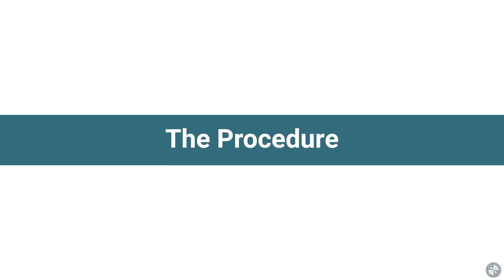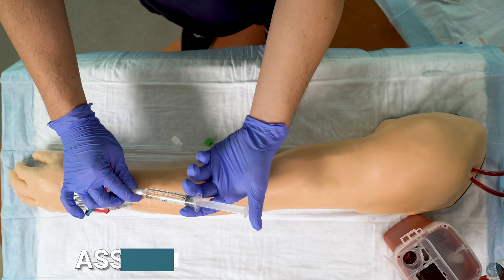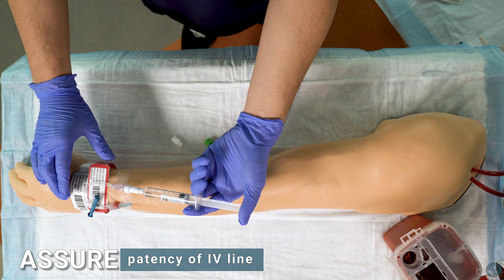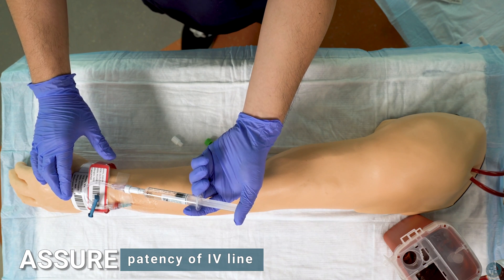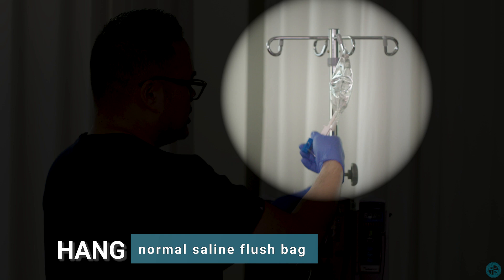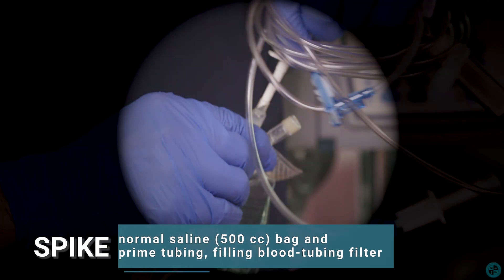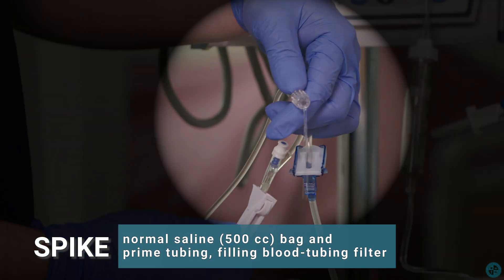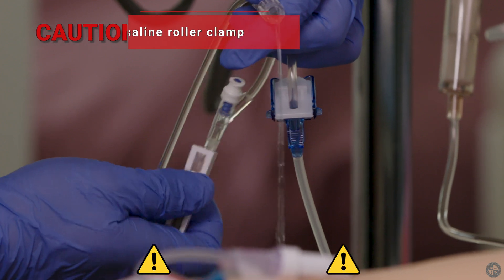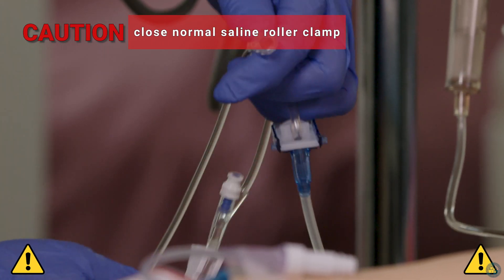The procedure. Assure patency of IV line. Hang normal saline flush bag. Spike normal saline bag and prime tubing, filling blood tubing filter completely. Caution: close normal saline roller clamp before continuing to the next step.